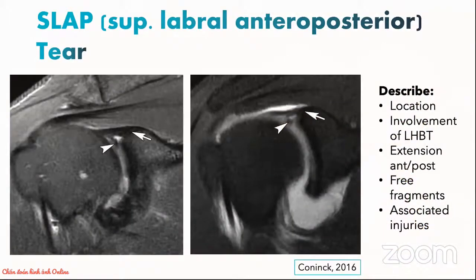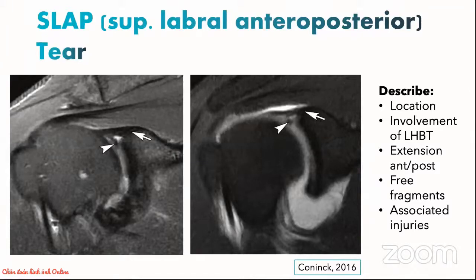Some examples of SLAP lesions: the coronal image on the left demonstrates a type 3 SLAP tear. The arrowhead points to the displaced bucket-handle flap from a superior labrum tear, while the arrow points to a normal-looking long head biceps tendon inserting into the superior aspect of the glenoid. The coronal image on the right demonstrates another superior labrum tear, but now the adjacent long head biceps tendon insertion is irregular and attenuated, so this actually represents a type 4 SLAP tear.